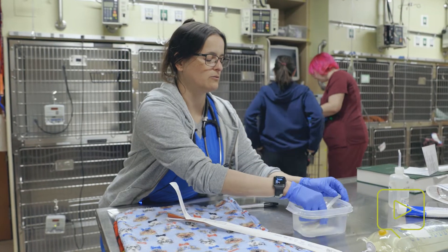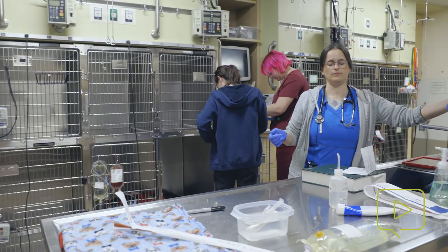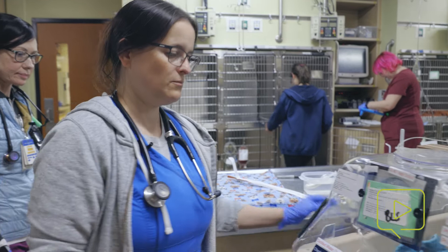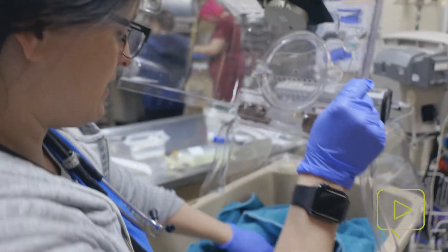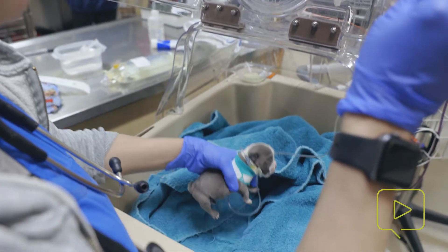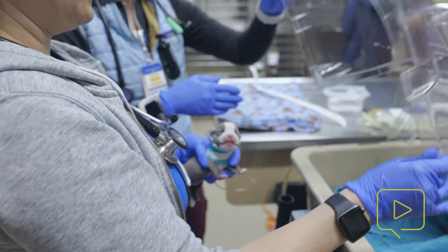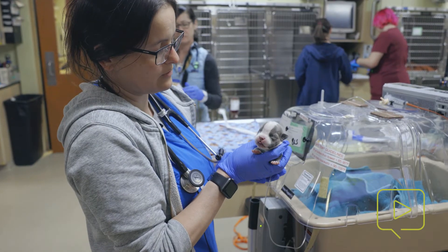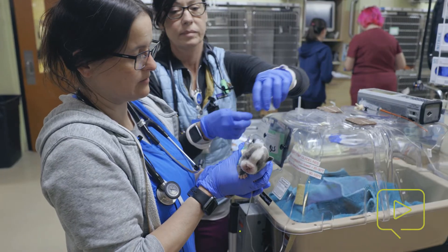So we'll get the baby out and show you how to do that. This little one is a 12-day-old bully who was born with a cleft palate. He was doing well at home with his parents tube feeding him, but then he didn't want to eat for a couple of days. So he's been admitted — he was very dehydrated when he came in, so he's on IV fluids with a jugular catheter, and he's been tolerating his tube feeding as well.